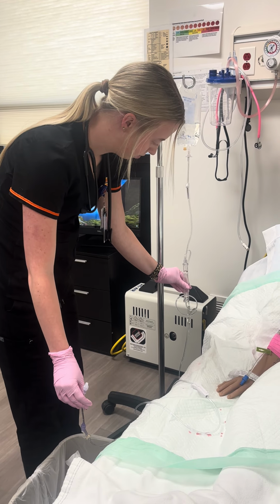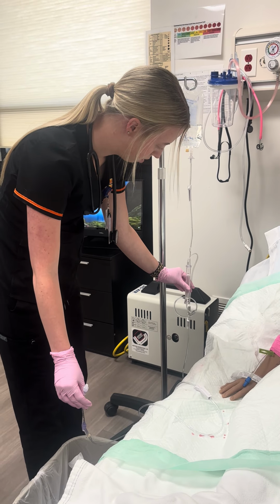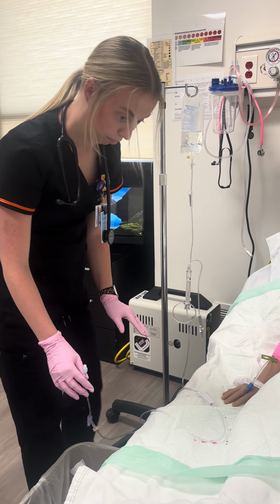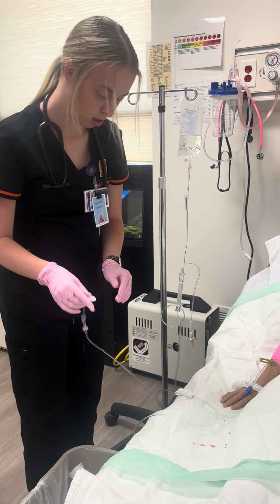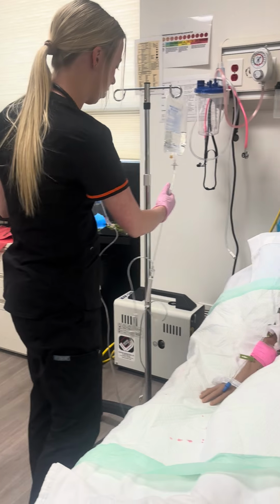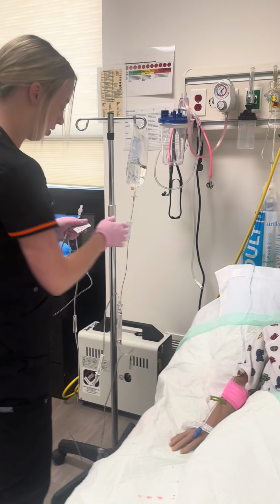Now that it is fully drained through, this is taking forever. My whole 15-minute video is me squeezing this. Bear with me. Okay, once we have ensured that this goes all the way through, which we have, I am going to clamp it off, just because we don't need it running right now.